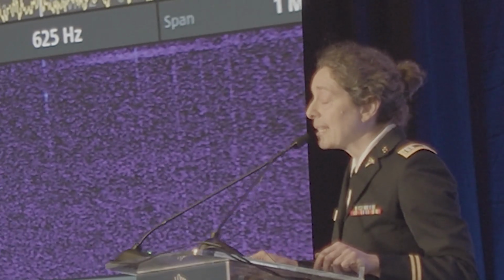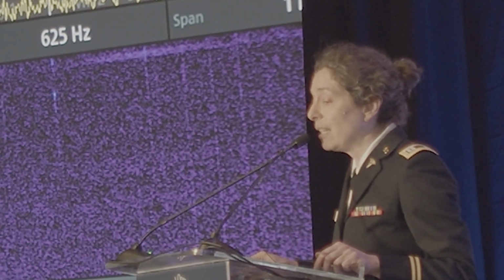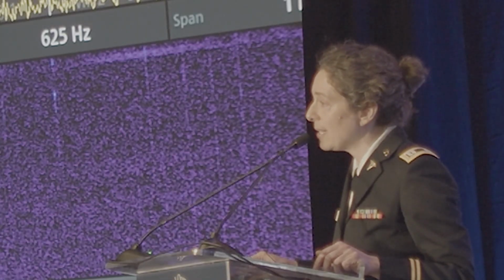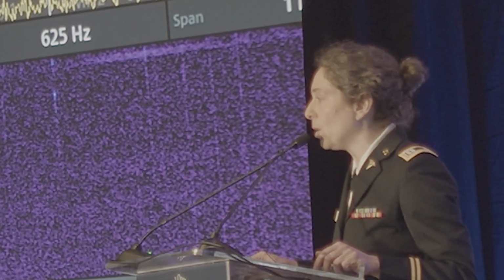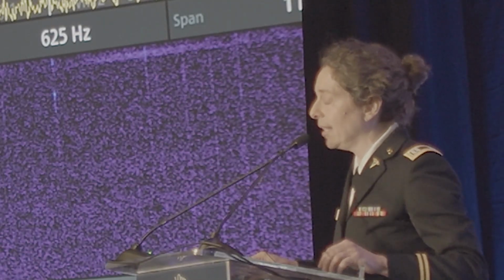The electromagnetic signature of the Sonosite M Turbo linear probe was detected at negative 135 decibel milliwatts. It was barely visible over baseline, and the baseline here is depicted by that red line.